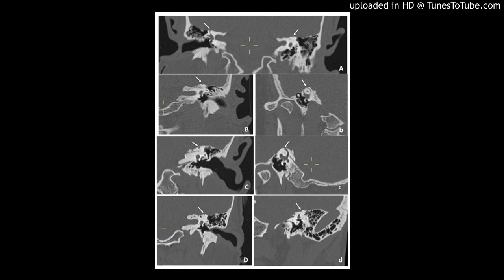Some bone dust is harvested at this stage and mixed with a non-ototoxic antibiotic, bone pate, for use as further graft material. If improved access is required, the sigmoid sinus can be partially exposed with the use of a diamond burr, allowing retraction of the sinus posteriorly.